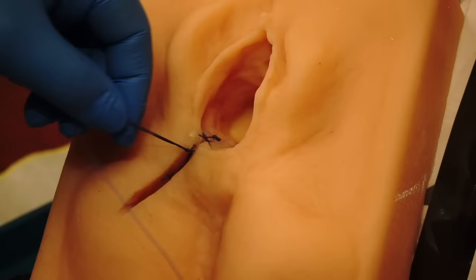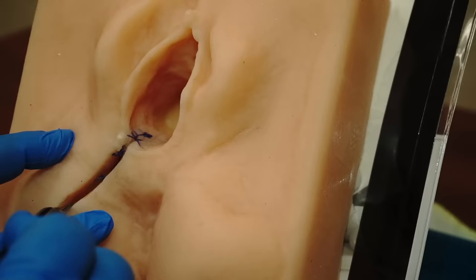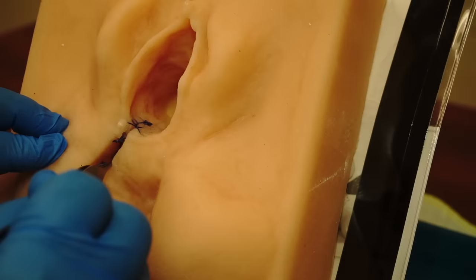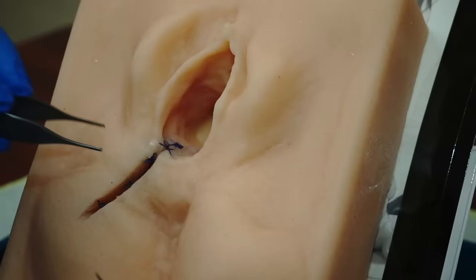Be careful when you cut this particular suture that you don't cut it too short, as that is your vaginal stitch holding the posterior vaginal wall together. Now the horizontal portion of the perineal repair is complete. Now we're ready to start the vertical portion of the repair. Opening up the pelvic model, you can see the deep sutures already placed prior to the crown stitch — they've closed part of the posterior vaginal wall. But here in the perineal body this part remains open, so you must close this area in layers as well. I would put a deep simple interrupted suture at this angle to help close this dead space and then proceed to the next layer.